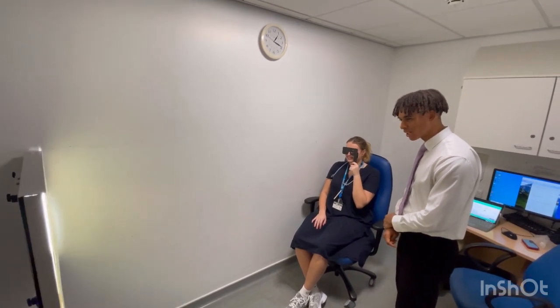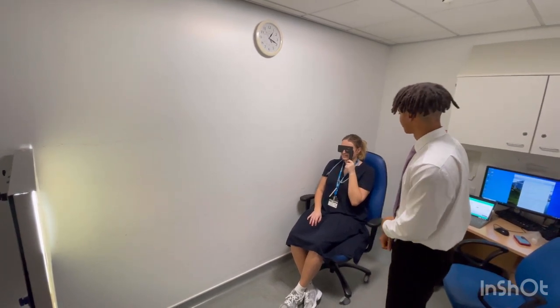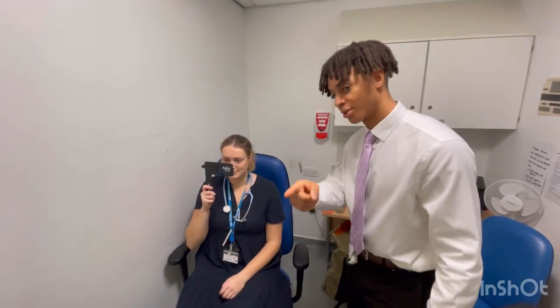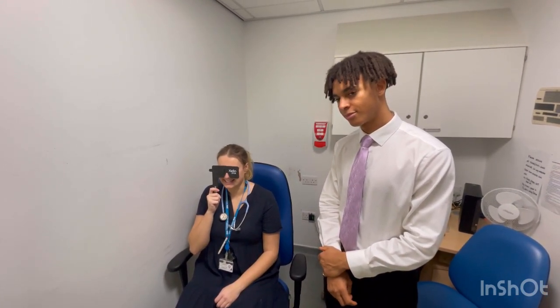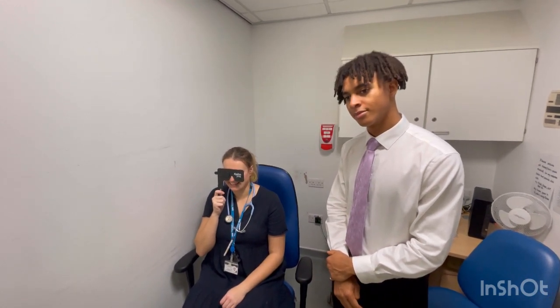If they don't reach the 20/20 line, the next step is to use the pinhole occluder and ask the patient if they can read any further down. If the patient is able to read any further with the pinhole occluder, that suggests that their visual problem is refractive, which might need glasses to correct it, rather than some sort of eye disease causing it.